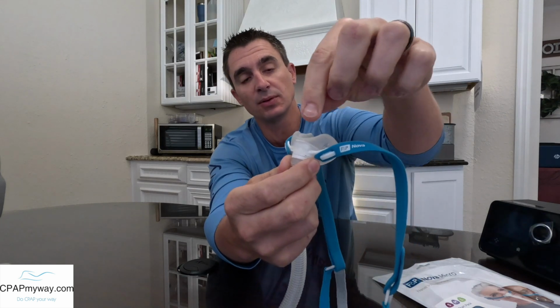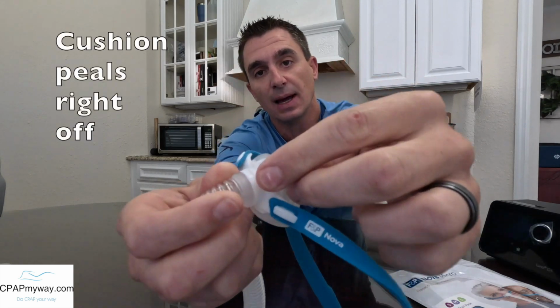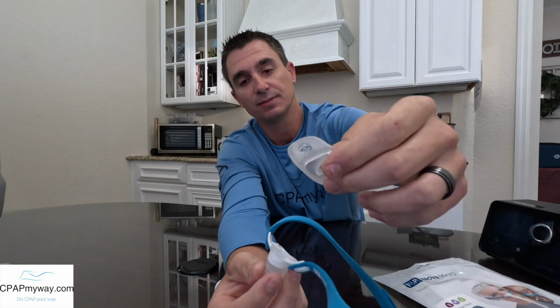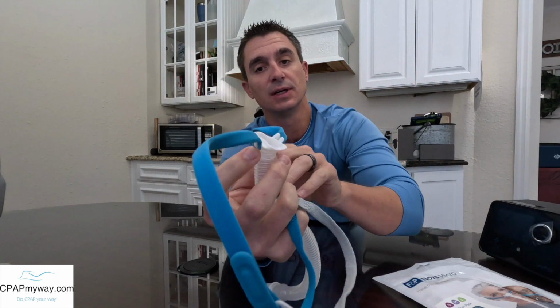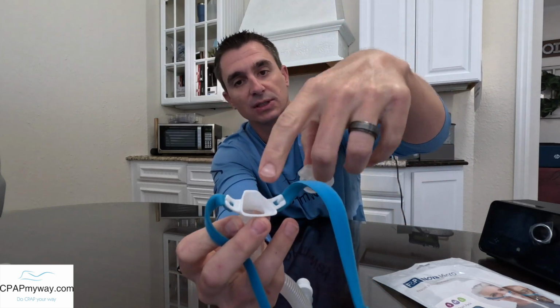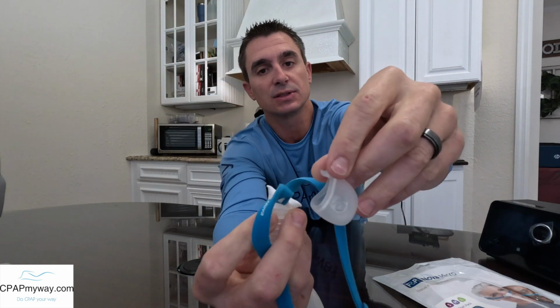Now, as far as the cushion or the pillow, whatever you want to call it here, as I said, this one's a medium. Taking this on and off is pretty darn simple. There are no clips or snaps or anything you got to line up. All you got to do is grab this little top flap right there, right? Peel it up and over, and the cushion comes off. And you will do the reverse to put the cushion back on there. I think the wide part at the bottom is the easiest place to start that, right? So you got the wide portion of your cushion, the wide portion of the frame there. Just slip that under, just like that.